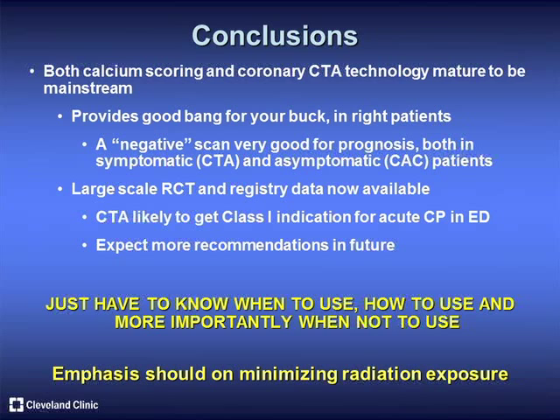You have to know what to use, when to use, how to use, and more importantly, I think it is important to know when not to use. Emphasis should always be on radiation reduction.